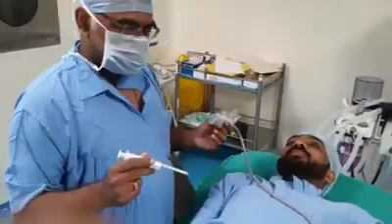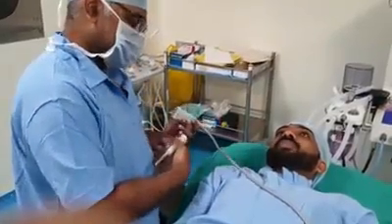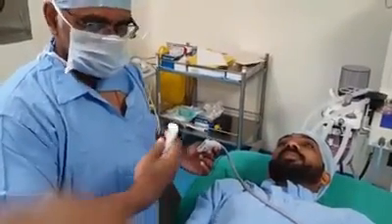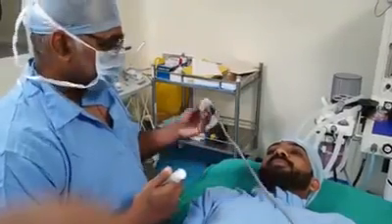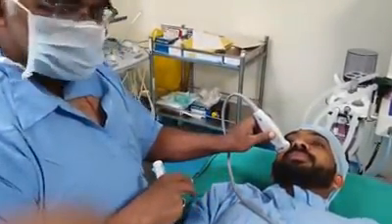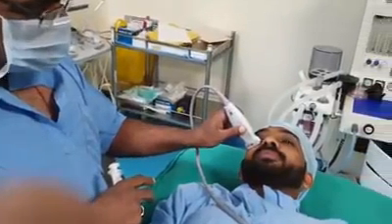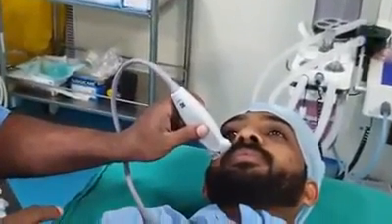Now I am going to do the right side sphenopalatine ganglion block. So I am standing on the same side of the patient. For better ergonomics, just opposite is my ultrasound machine. So same way, this is my probe. I will be keeping it on the zygomatic arch. Slowly I will be going inferior.